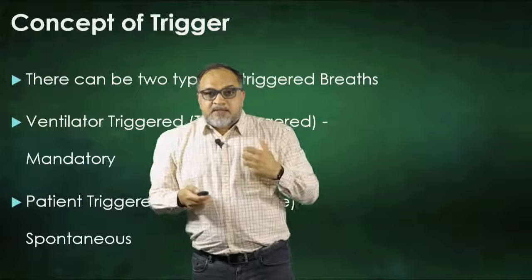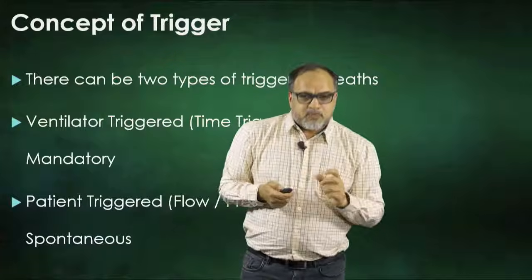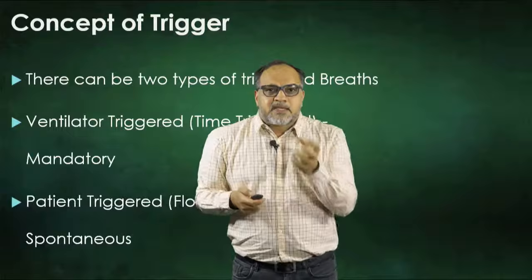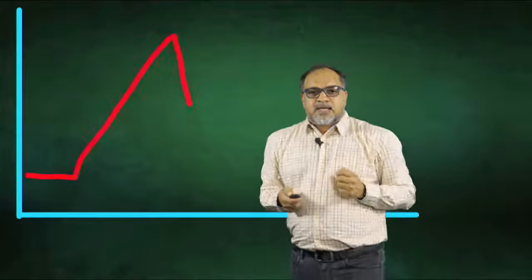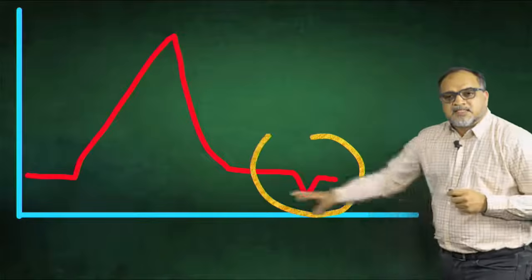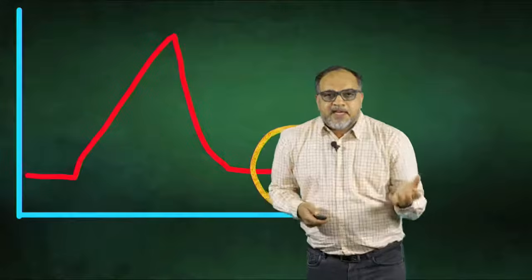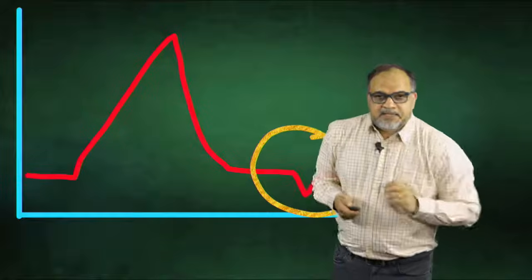Whenever we breathe in a negative pressure ventilation mode, I told you that whenever the patient is on a ventilator and tries to breathe, he creates a negative pressure, a suction, and that suction is sensed by the ventilator. It looks like this on a graph. This is the suction created by the patient. This is called the trigger, or the patient trigger. All the ventilators are trained to catch this trigger and provide a breath according to the settings.